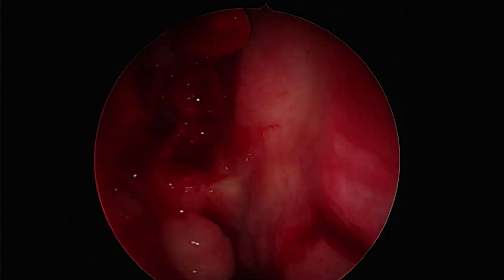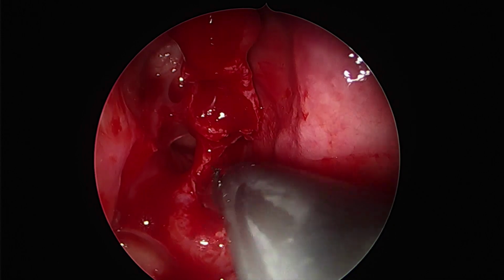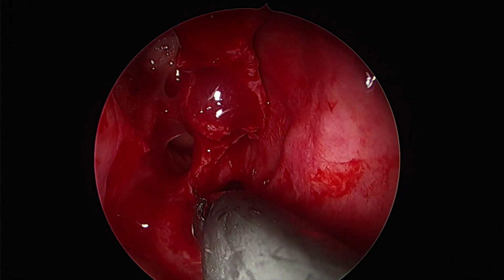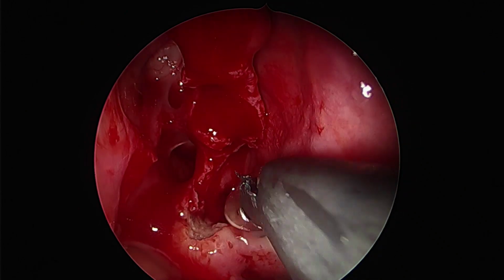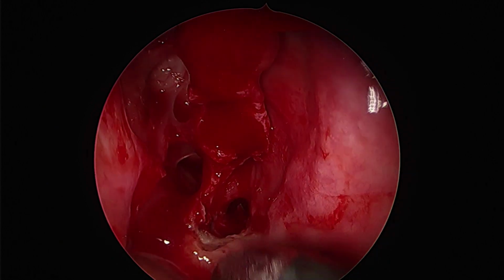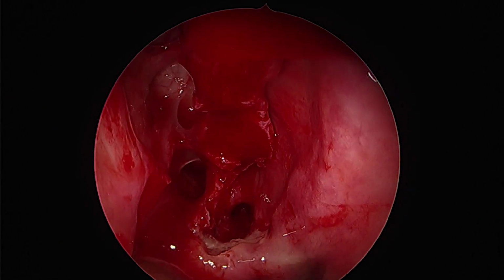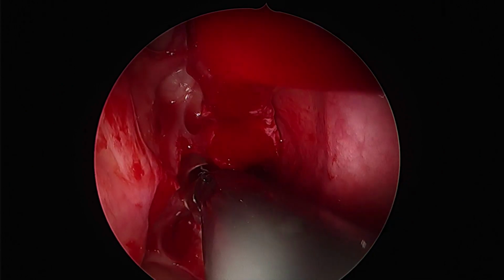While maneuvering in the sphenoid sinus, it must be borne in mind that the blade of the shaver must always be under vision. No blind use of the microdebrider blade inside the sphenoid sinus cavity is ever recommended. Achieving good hemostasis prior to proceeding further is very important. Here we are using the same coagulation wand to achieve hemostasis at our entry point into the sphenoid os. So our surgical field remains clear and we remain oriented.